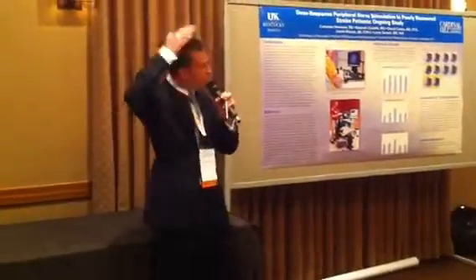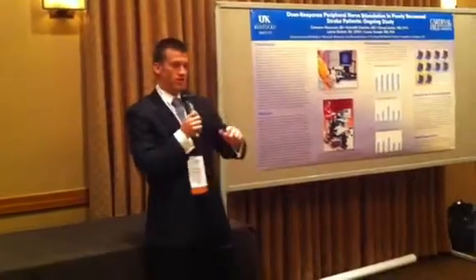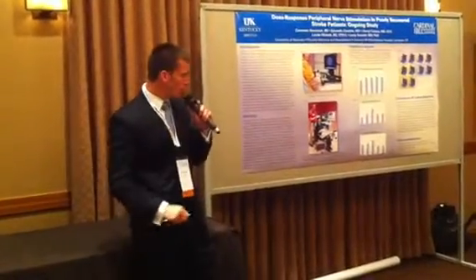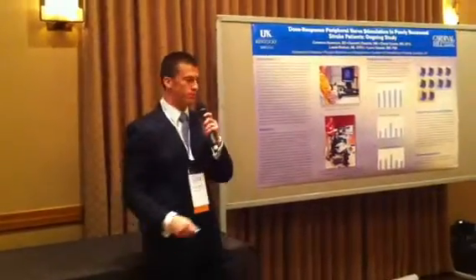So the way this works is I'm holding the coil, and it makes a big tap, tap on the patient's head, and we will see a response in the target muscle. So depending on where I'm placing the coil, we'll see a response in the corresponding muscles. What we're interested in there is going from spot to spot to see what parts of the brain give us responses in our target muscles.